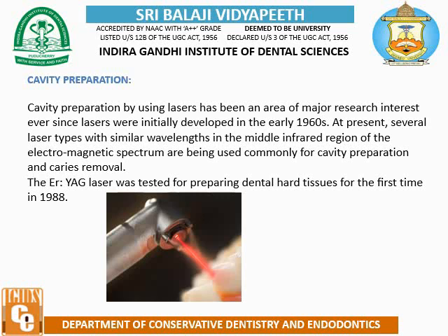Cavity preparation. Cavity preparation using lasers has been an area of major research interest ever since the laser was initially developed in the early 1960s. At present, several laser types with similar wavelengths in the middle infrared region of the electromagnetic spectrum are commonly used for cavity preparation and caries removal.